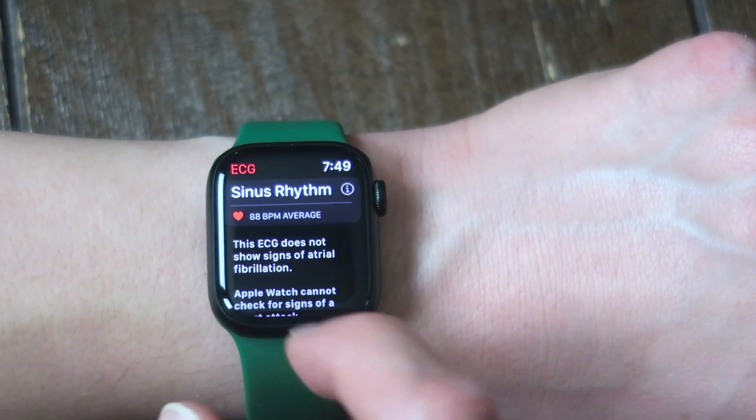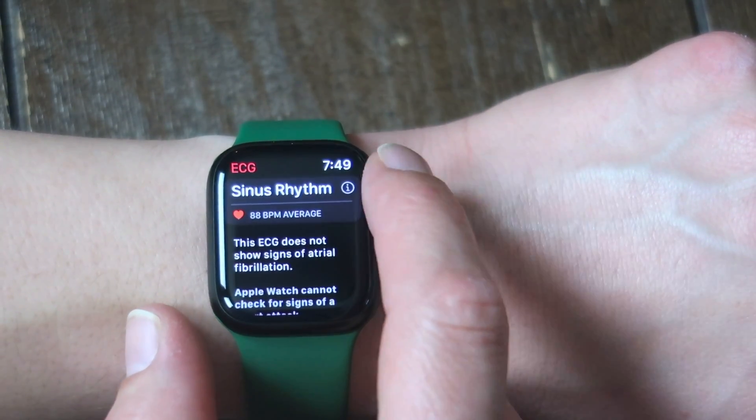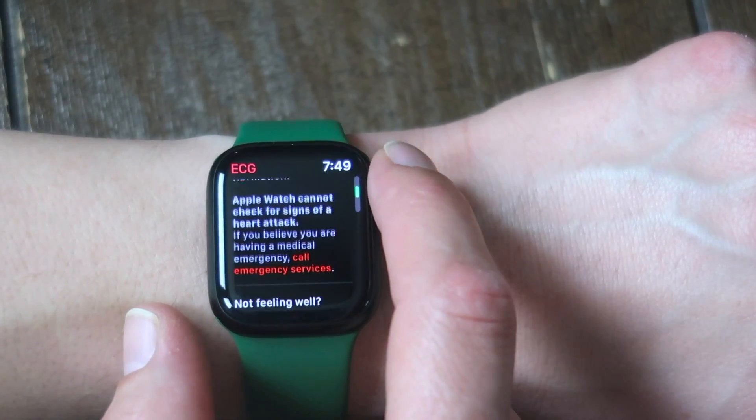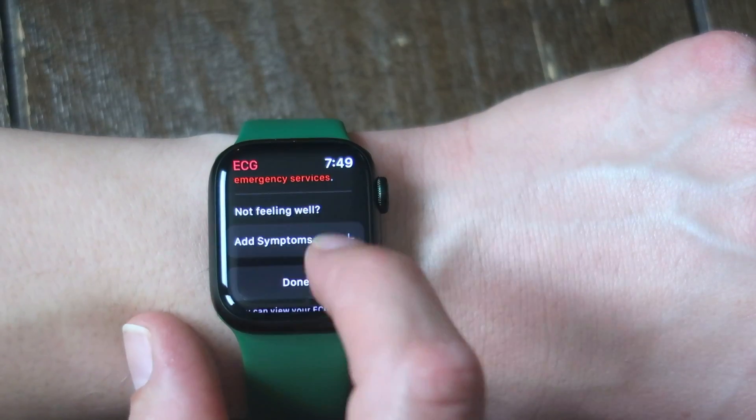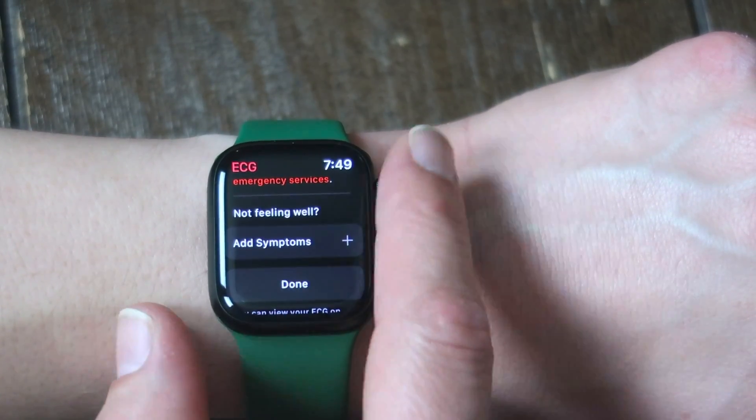It's showing sinus rhythm. This ECG does not show signs of atrial fibrillation. You cannot check for a heart attack, so if you're dying from a heart attack, call emergency services. You can also, if you're not feeling well, add symptoms and kind of keep a log.